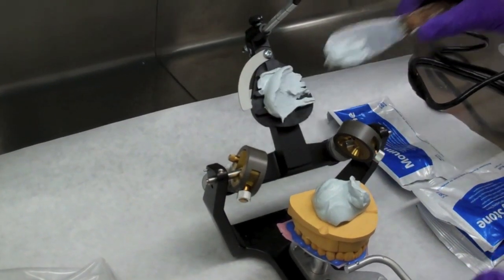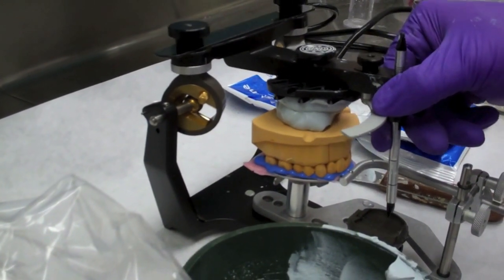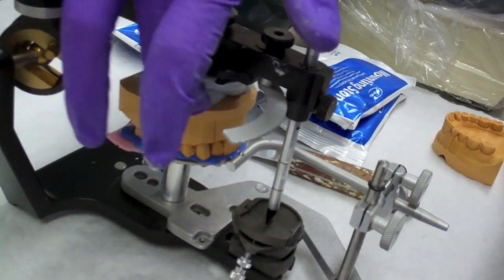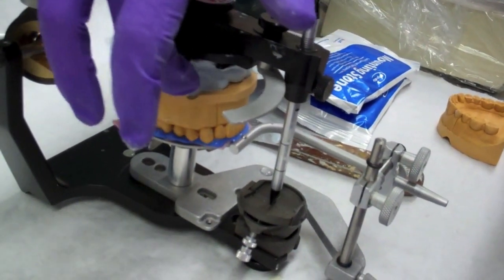Once stone has been applied to both sides, close the articulator. Note there will be voids. This step is only to secure the location of the maxillary cast on the articulator.